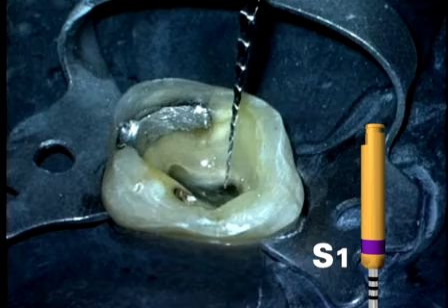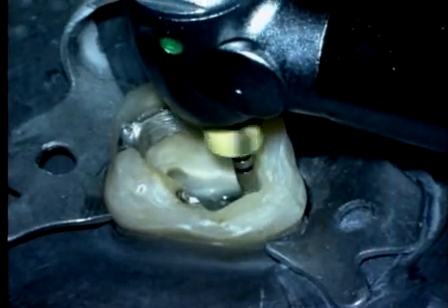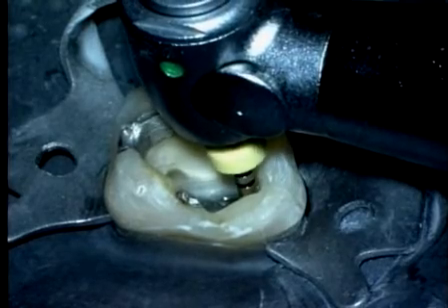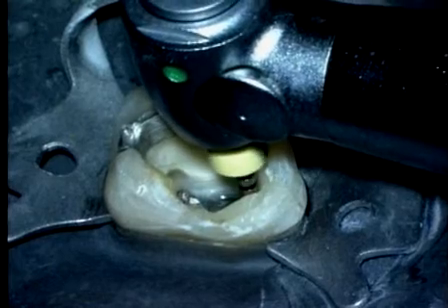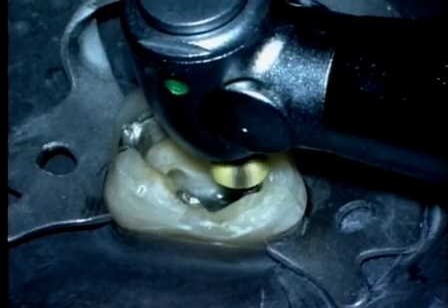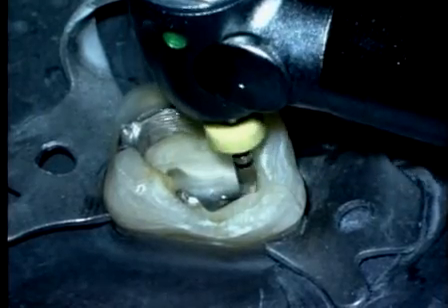This instrument has a purple identification ring on its handle. The instrument is carried into the canal, and generally it can achieve length quite easily. Sometimes we'll lift the instrument up just a little bit to allow debris to more effectively auger up its cutting blades. Once we've achieved length, the instrument is withdrawn.